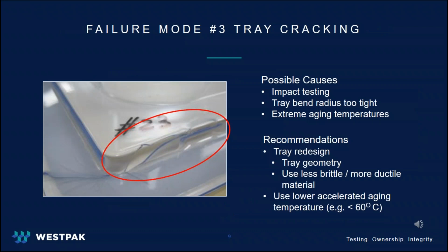The third failure mode we see a lot of is tray cracking. This can be caused by a few factors. One of which is if your tray material is too stiff. Another is if your tray isn't properly designed. An example of this is having a bend radius that is incorrect. Another cause may be using accelerated aging temperatures that are too high. Using high accelerated aging temperatures can cause the material to transition or degrade. The failure mode is usually manifested during impact testing and is quite obvious during gross leak testing.